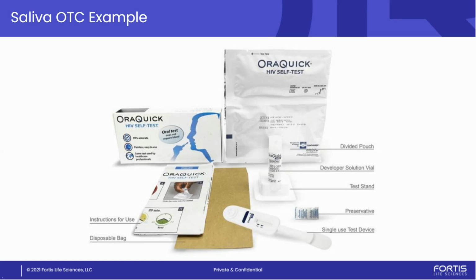So starting with sample collection. They use a single test device that has a sample collection built in to the strip. So the swab at the end, or sample collection pad, goes into the mouth, collects that sample, which wicks up the stem and into the strip. So your sample collection and sample processing is occurring there.